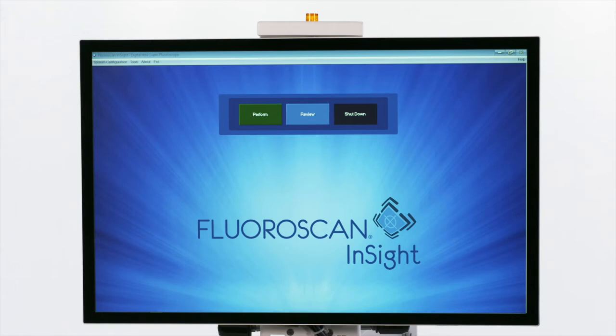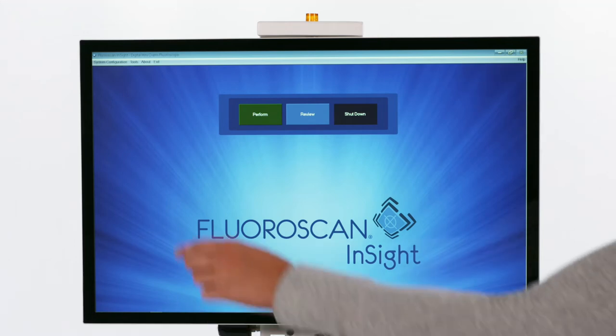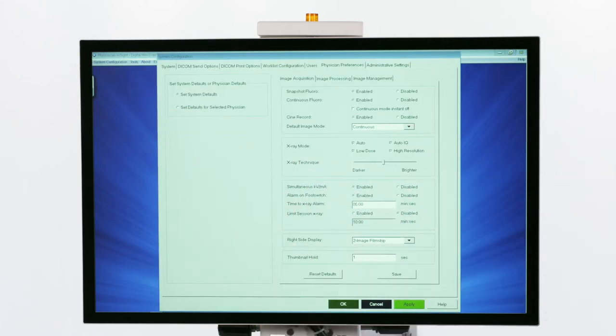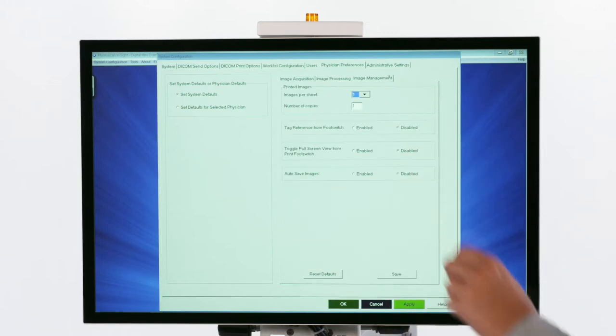There is also the option to change physician preferences — simply click System Configuration, then Physician Preferences. Here there are many options. For example, if worried about losing images, enable the Autosave option here.